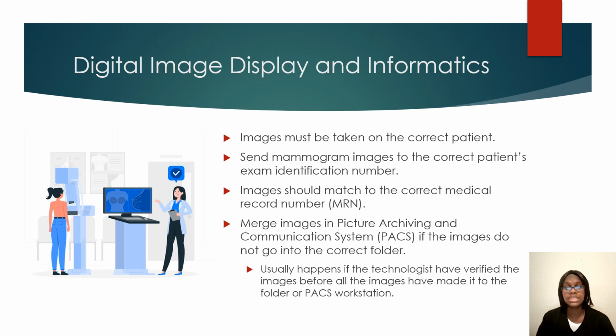So always match up your patient's name from their wristband, if they have one, to their order and the requisition form that you have in your hand. Put it up to the monitor and make sure that you are comparing the names, especially if you have someone who has a similar or the same last name and a similar first name. It's easy to confuse your patients.